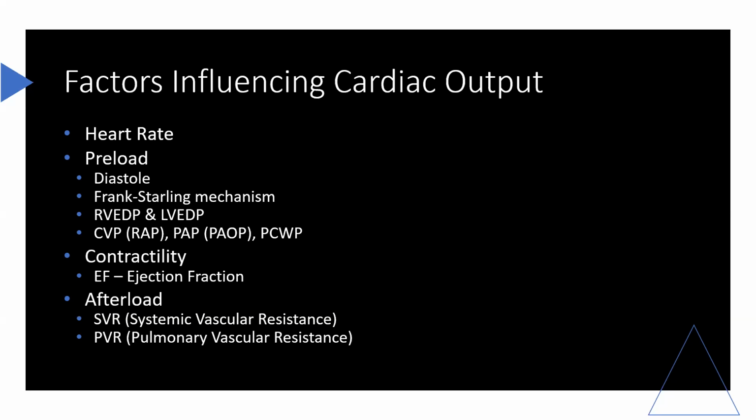Alternatively, contractility can be estimated by calculating the slope of the ventricular pressure time interval during the initial period of contraction. This change in pressure relative to time is thought to be a practical way of estimating the force of ventricular muscle contraction.